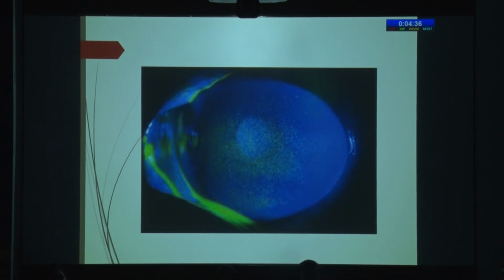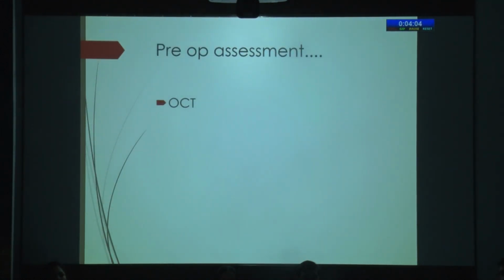This patient, if he has a biometry done, will it be accurate? Never. So we have to ensure this is treated first, then we are addressing the patient's cataract. So these are the things which we have to take care of. And quite often the patient comes to us after being seen by the optometrist on the same day, dilatation drops, IOP being checked, and in those situations, if we advise cataract surgery workup, they can end up with wrong biometry because the surface is already having some distortion. So they have to be checked again if required.